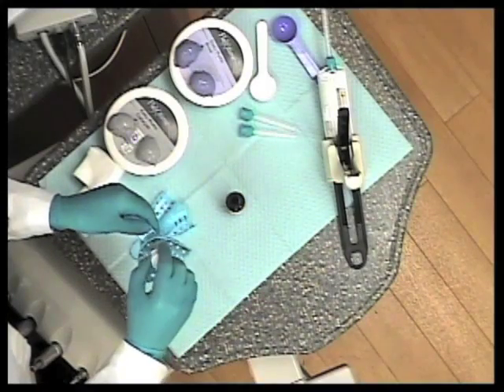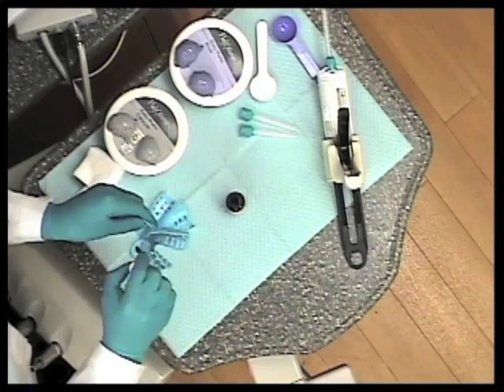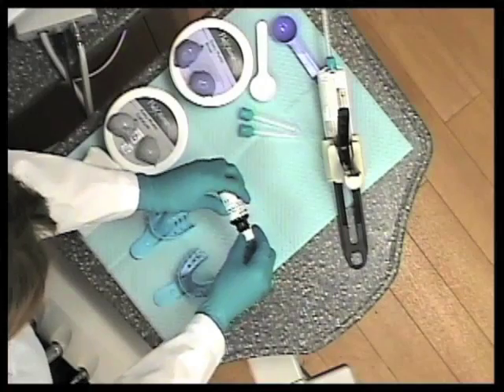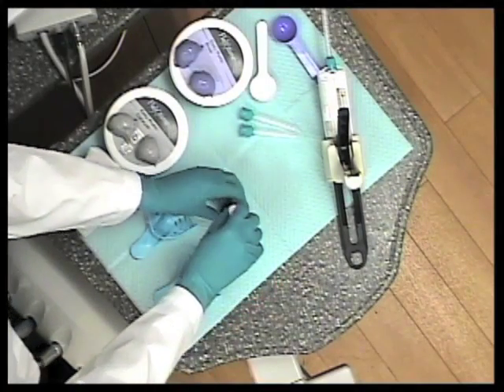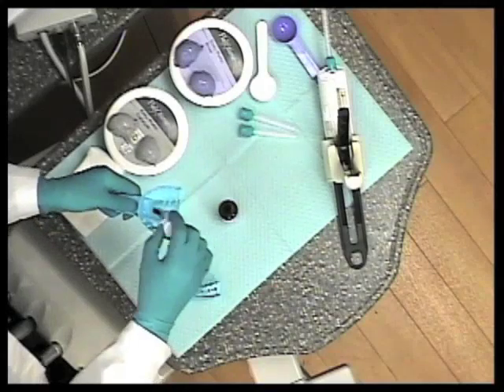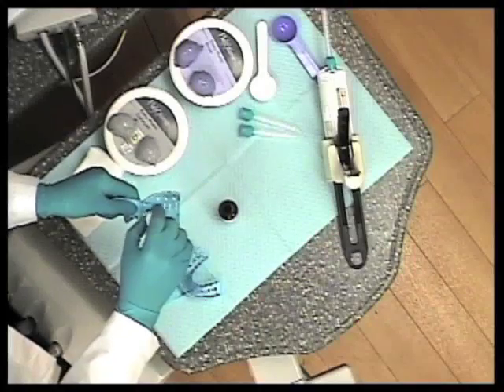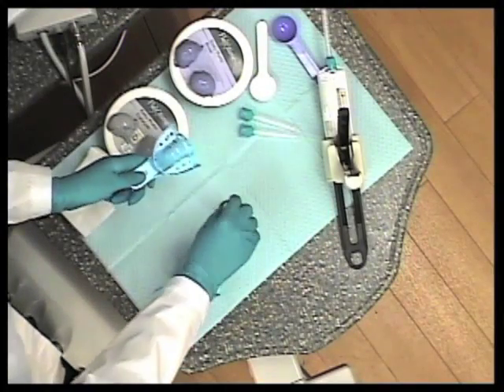Some of you are probably worried about the cost of this involved compared to alginate, and there is some additional cost in terms of using this material. But here again, one of the things that we're recommending, particularly on the cases that are more complicated, is to have 2 sets of models.